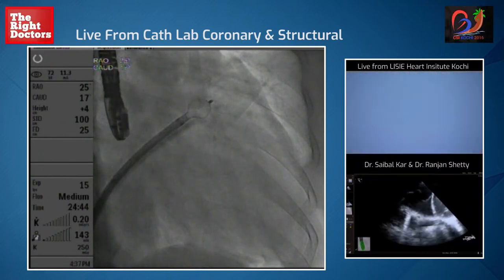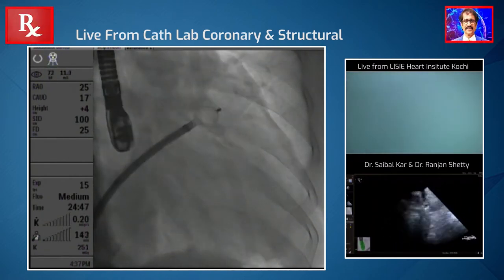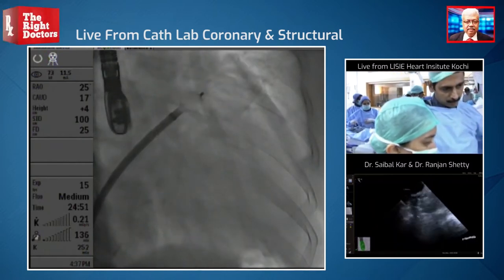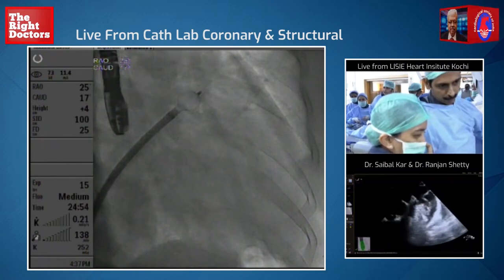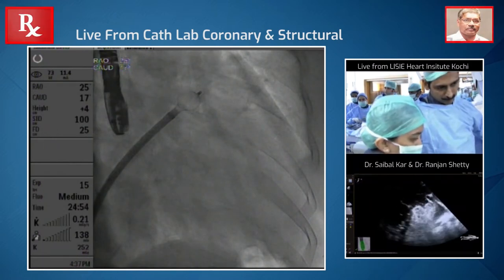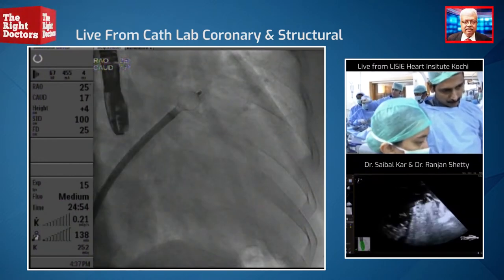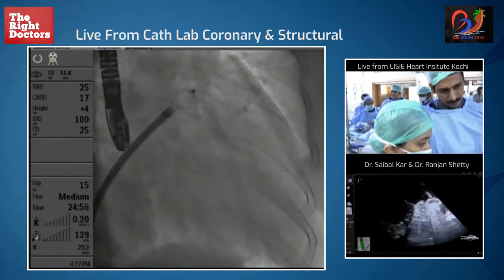So what we want to do is this ball — we want it to be a little deep. At this point we make an anticlockwise torque, and then start. So my sheath is very counterclockwise. We need to see echo to see where we are. Now we can see — you can see a part of the device is there. So do 45 and 135.